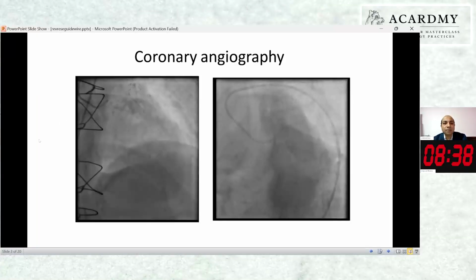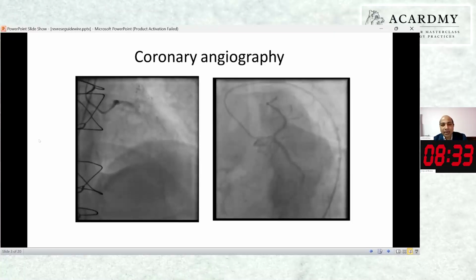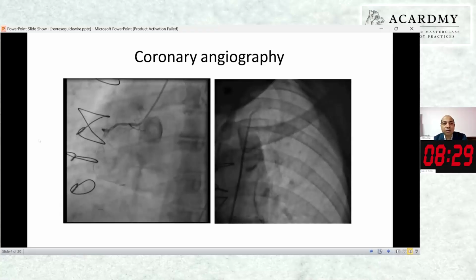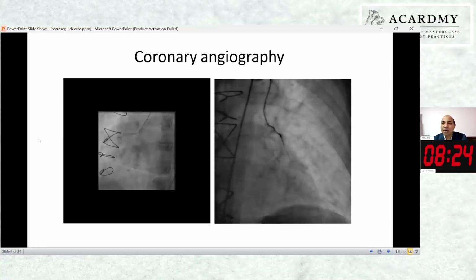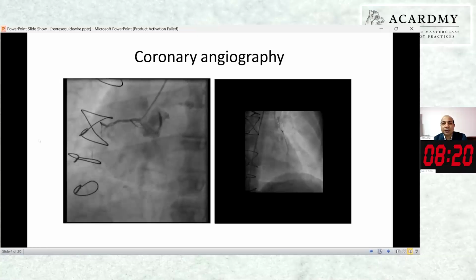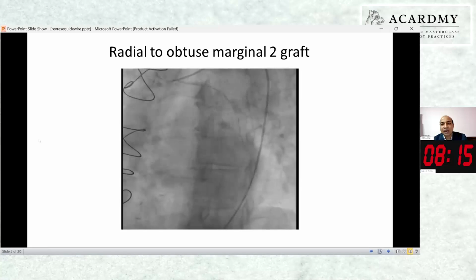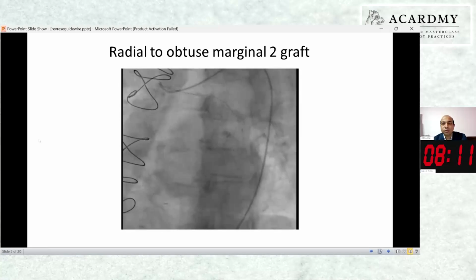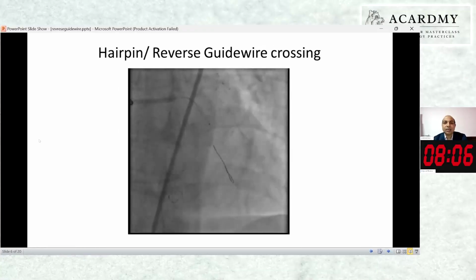So this is the angiogram showing dominant left circumflex artery and LAD, some disease in the proximal segment, and this is the non-dominant right coronary artery, and LIMA to LAD, although patent, but there's already an antegrade flow from LAD. And this is the graft, the atretic left radial artery graft to OM. So this is the culprit artery. So we chose PTCA to LCX and OM2 with two drug-eluting stents.